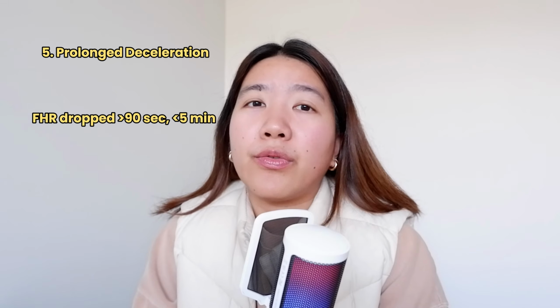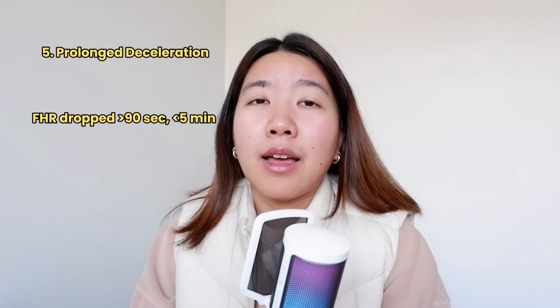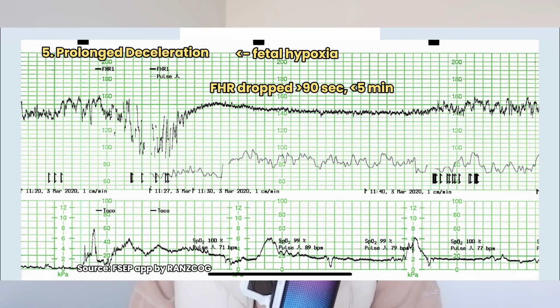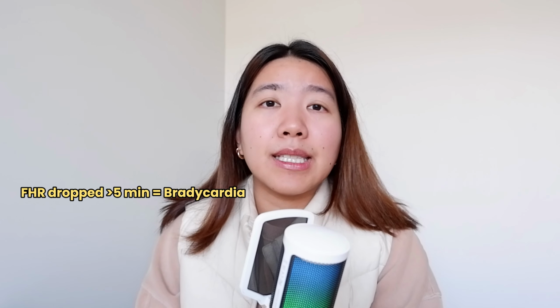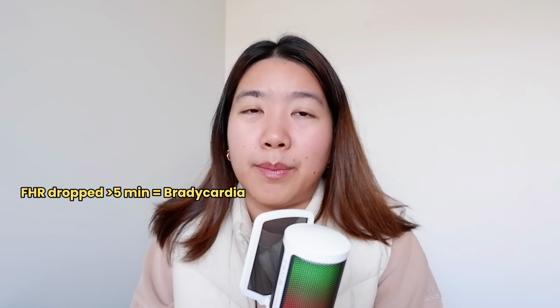Number 5, prolonged deceleration. Prolonged deceleration is a dropping of the fetal heartbeat for more than 90 seconds to 5 minutes. It is caused by fetal hypoxia, and it is a medical emergency and requires immediate escalation. If the fetal heart still continues dropping after 5 minutes, then we call it a bradycardia, which is also a medical emergency as well.